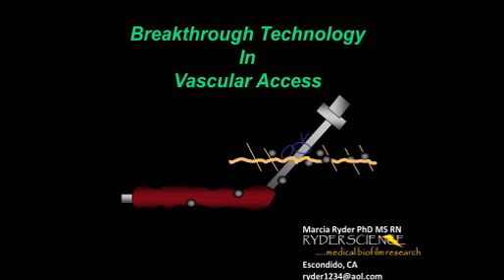We need to utilize practices such as patient assessment for the right device for the right therapy. We need to assure proper catheter tip position. We need to use shorter sheaths and shorter dilators to reduce vessel injury. We need to use scrubbing devices for access site and catheter hub disinfection. And we also need to rethink the use of tapered PICCs. And lastly, we've got to begin to better utilize and assess new technologies that will help reduce these complications.